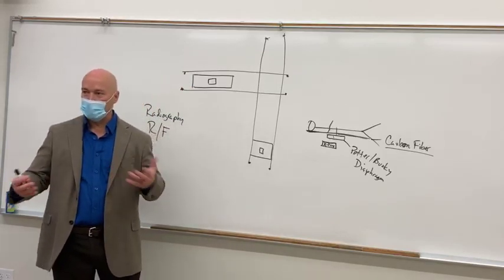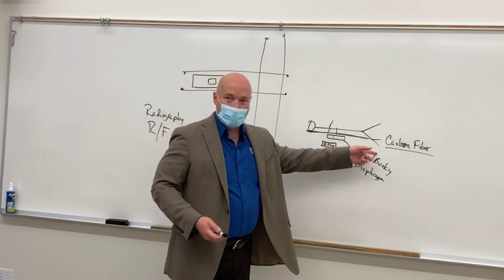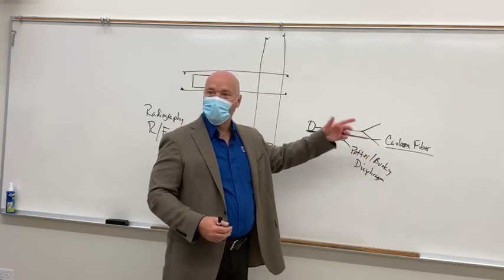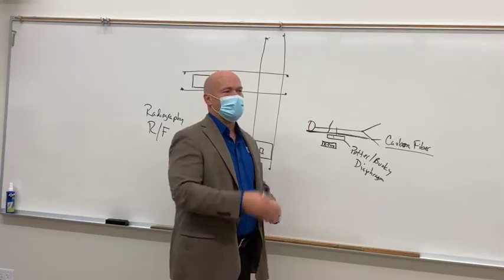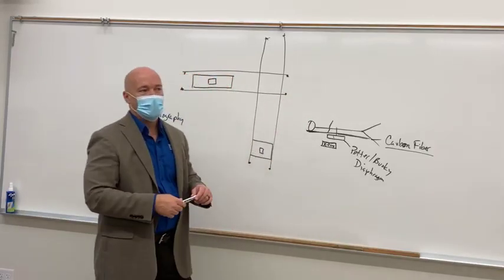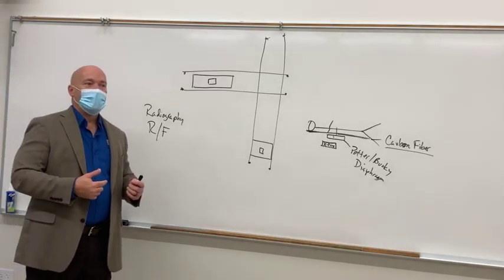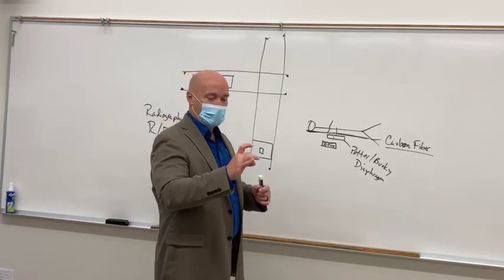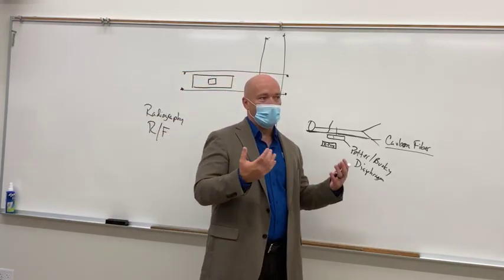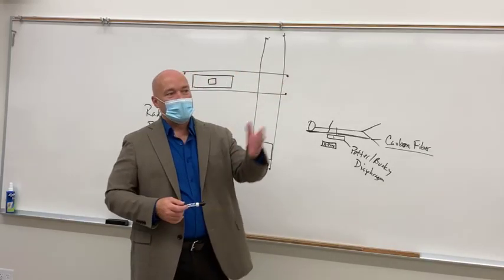yeah, what's it made out of? Metal, right. So metal, is it carbon fiber? No. So is it easy to penetrate through? No. And you can't really see it from here, but that x-ray up there, when you pass by after we get done, what you'll see are a lot of wires, right? So it looks like you got these round circles going maybe around the patient's aorta or whatever. It's not the aorta, it's the sternum.